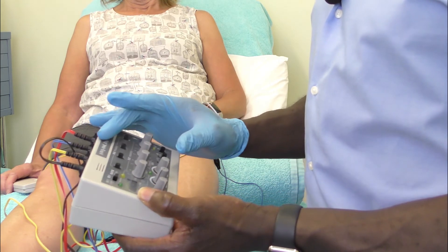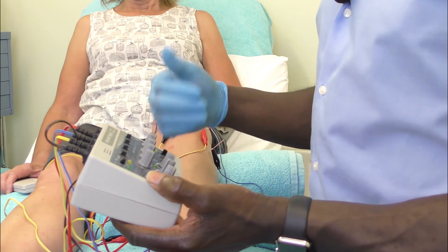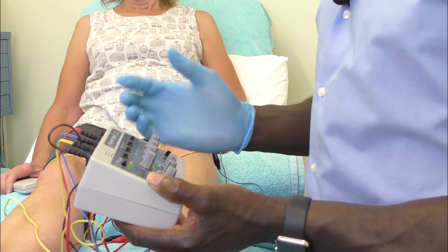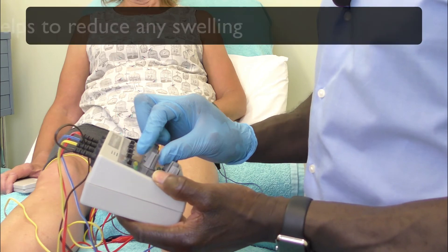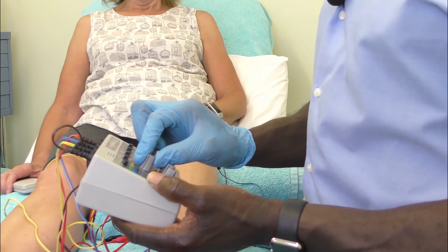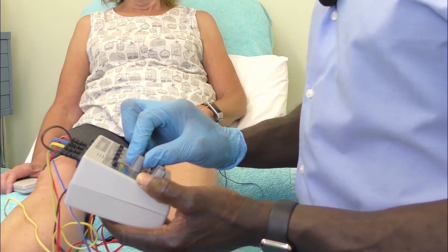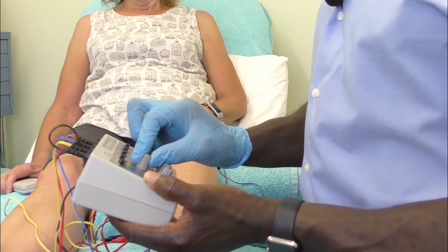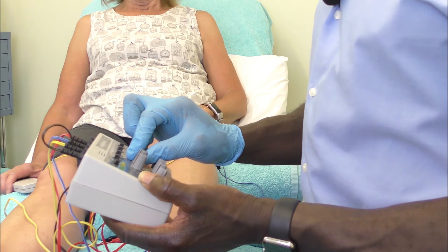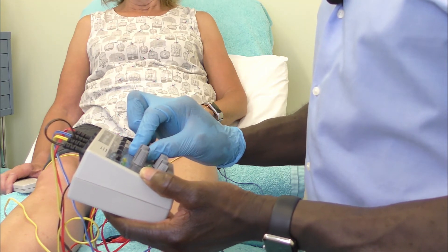You can set it to positive or negative. Negative is going to deal mainly with pain; positive is for bone regeneration, which isn't something we're going to focus on with an osteoarthritic knee. So I'm going to keep it on negative primarily to deal with the pain aspects. I'll start to click it up — just tell me when you can feel it and let me know when it gets to a comfortable level.